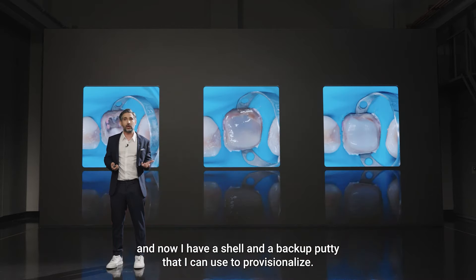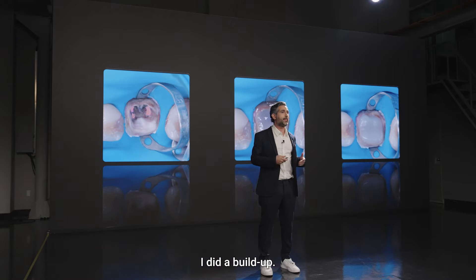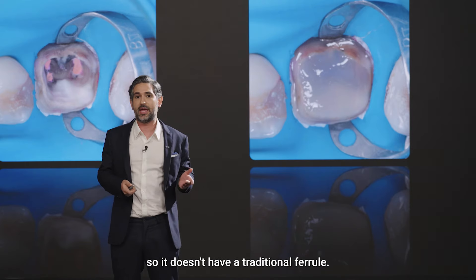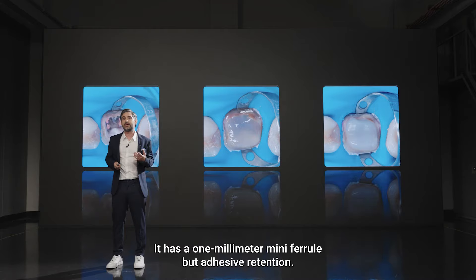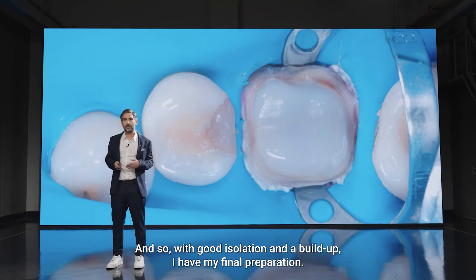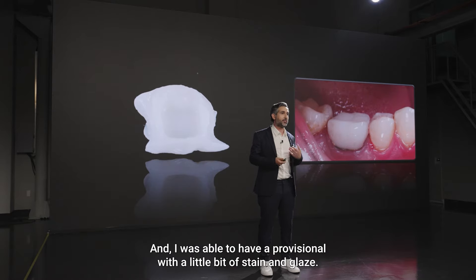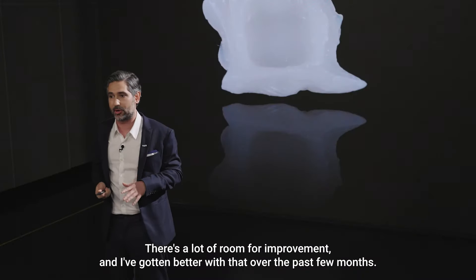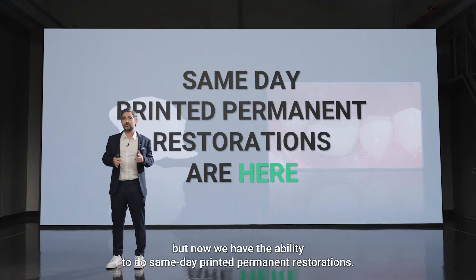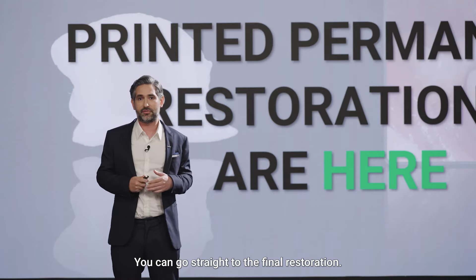She came back from her root canal and I had a shell and a backup putty to use for provisionalization. I did my biomimetic approach using rubber dam, did a buildup — these restorations don't need retention in the traditional sense, so no traditional ferrule, just a one-millimeter mini ferrule with adhesive retention. With the shell provisional relined, I had a provisional with a little stain and glaze. But now we have the ability to do same-day printed permanent restorations — you can go straight to the final restoration.